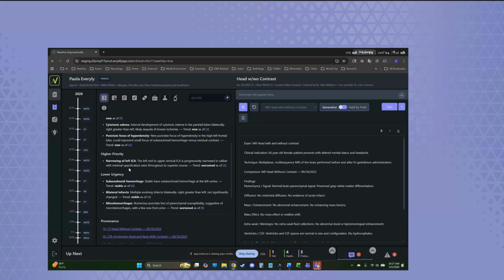Modern large language models are getting better and better at this, and it's intrinsically becoming less of an issue, but that's not good enough. So we architect careful guardrails to make sure that our system gives you accurate information. So that includes things like carefully defining our inputs, the scope of the analysis we're asking the system to do, carefully formatting our outputs. We include things like a temperature of 0 and strict JSON formats, for those of you who know what those things are. We ask the language model to explain its reasoning, so that we can see what it was thinking about, what it was working through. And we always make sure that we have provenance so we can go back and see where the information is coming from.